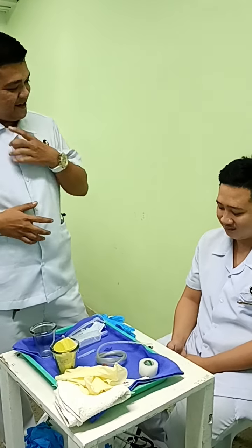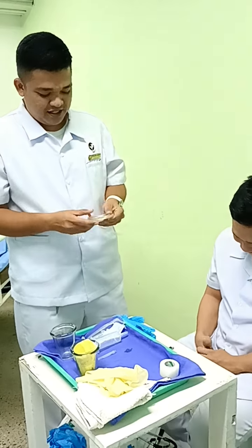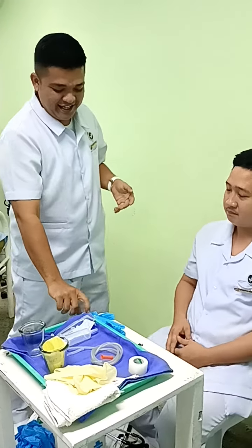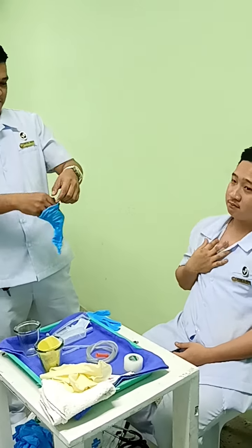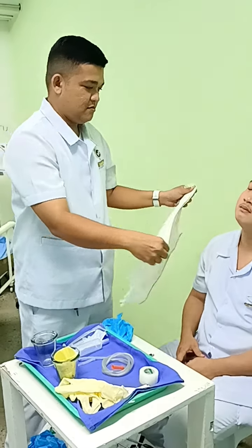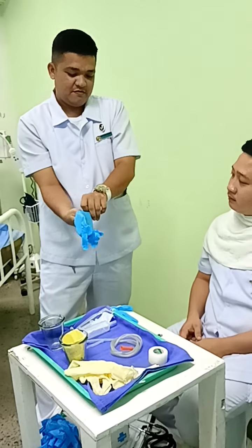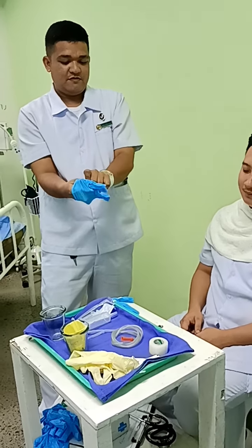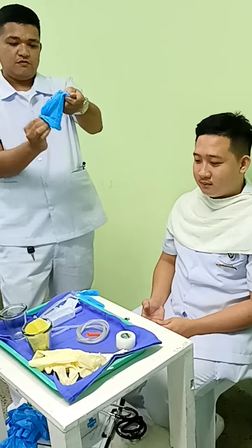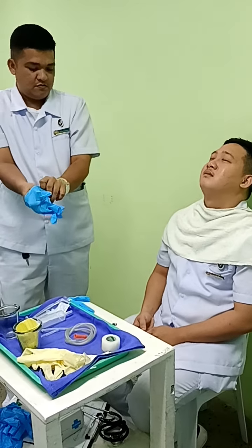First is to wash your hands and then do the gloving. Now we're going to determine the length of the tube that needs to be inserted inside the patient. So we're going to measure it first. Start here at the outer part of the nose.